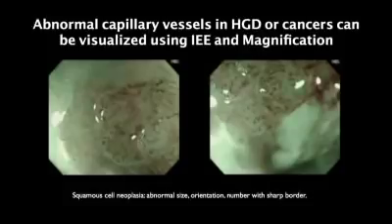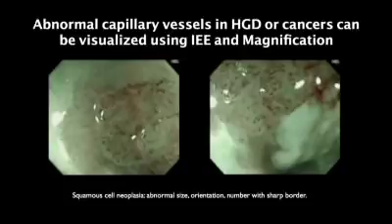Image-enhanced endoscopy enhances the visualization of the abnormal capillary vessels in high-grade dysplasia and cancers. The abnormal size, orientation, and number of surface capillaries with distinct borders are characteristics of squamous cell neoplasia.